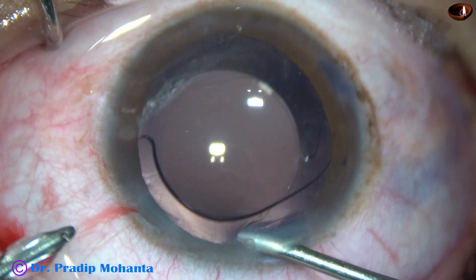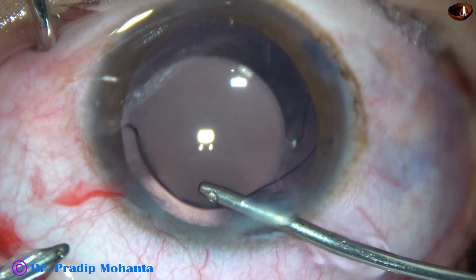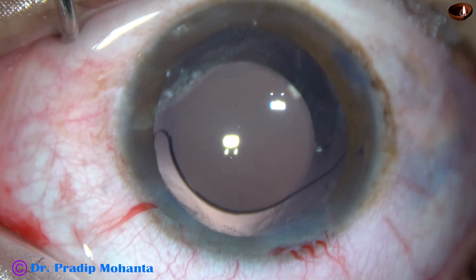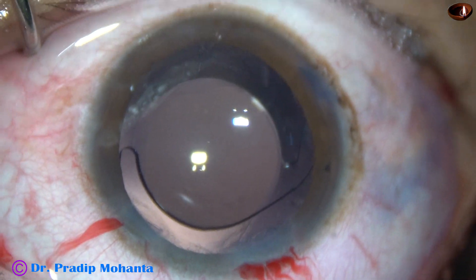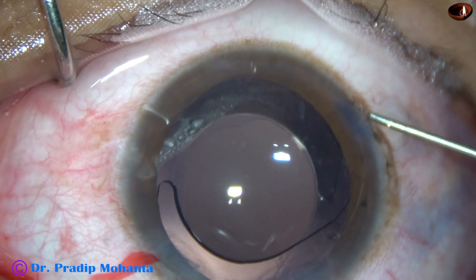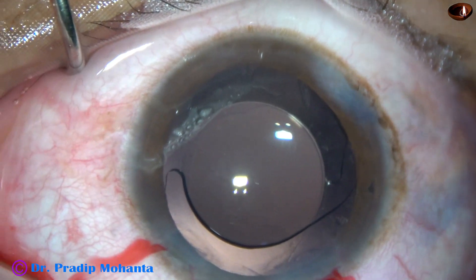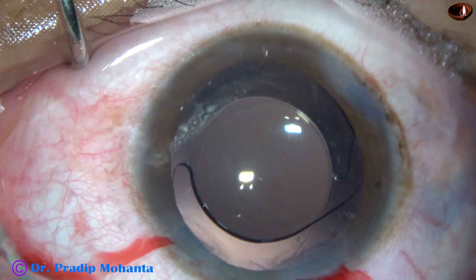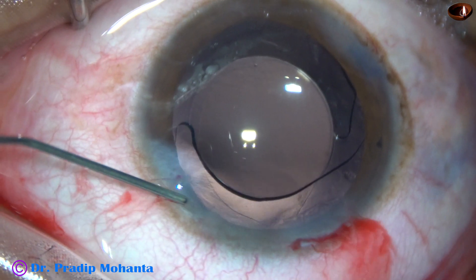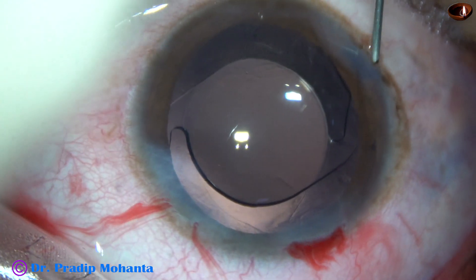So the case is nicely done so far. Though a complication has occurred, we have managed it very nicely. The lens is nicely centered. So whenever a complication occurs, from that moment we must take extra care so that we can manage the case beautifully and the patient's visual recovery is not affected.